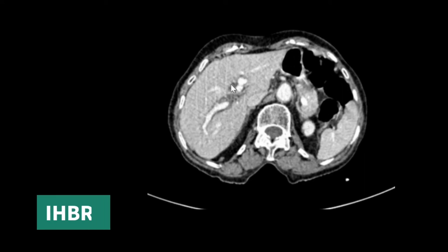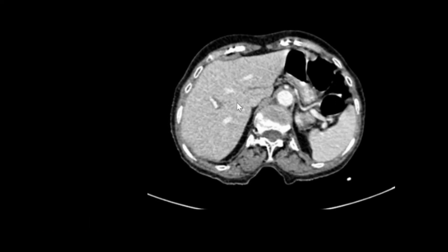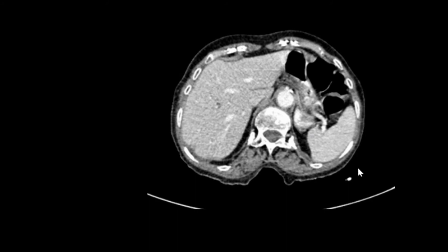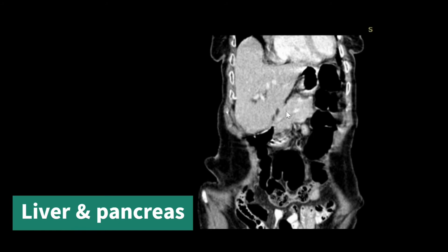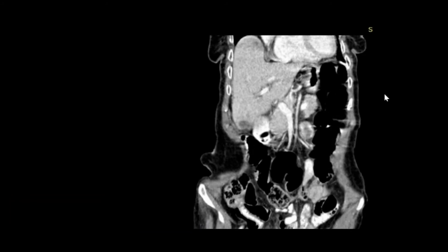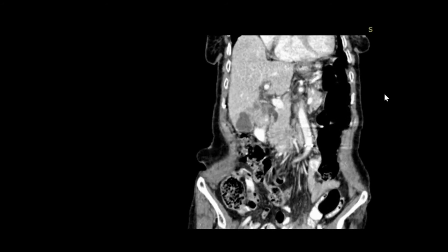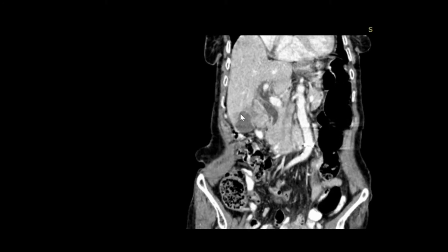More so in this case, there is central IHBRD which is seen, and the peripheral ducts appear more or less normal. Let's move on to the coronal sections of the same case. You can see liver and pancreas, and as we move posteriorly, we begin to see the mass in the gallbladder fossa.